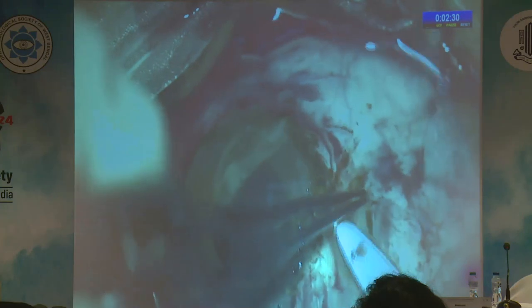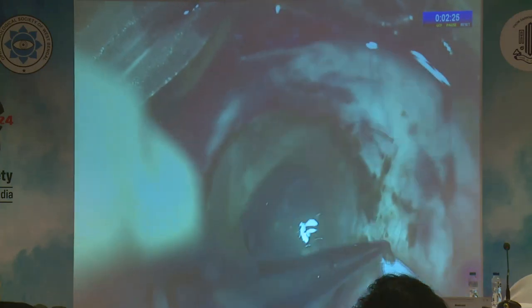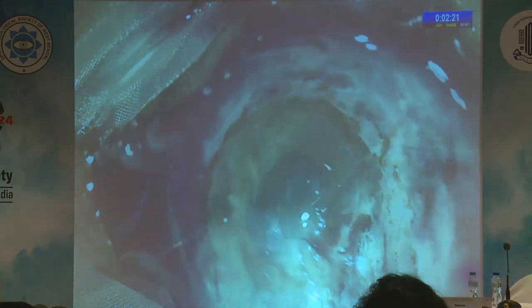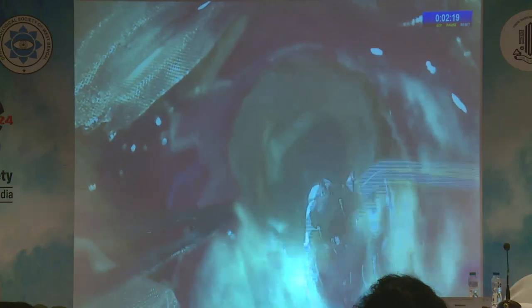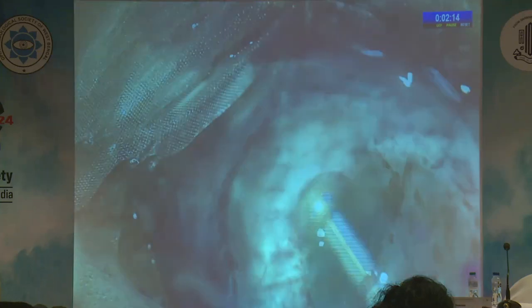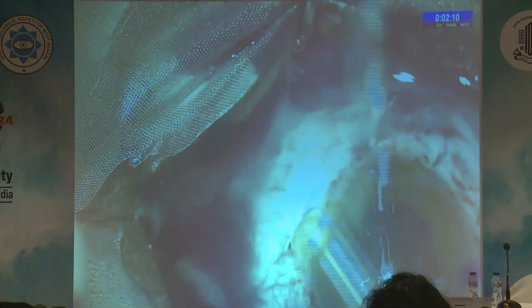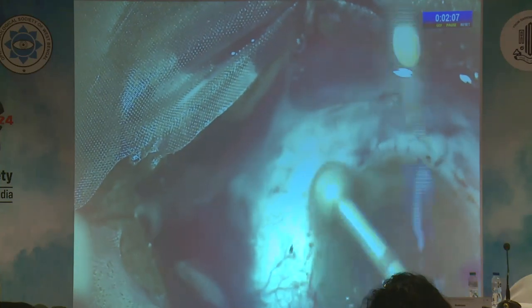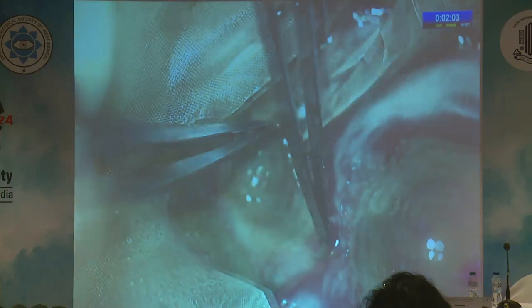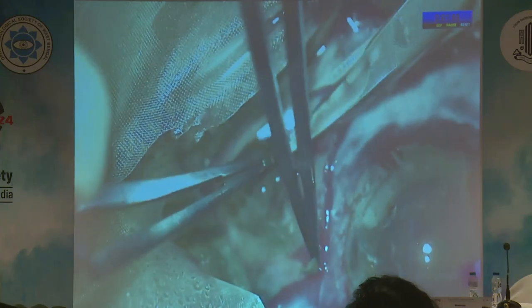In the temporal region, an area of deep episcleral invasion was noted, which was removed by superficial lamellar dissection. The rest of the nevus was cleared by multiple techniques, ranging from scraping with a blade to lamellar dissection. A diamond bar polisher was used to remove the residuals of nevus over the cornea. The part over the caruncle was removed partially to avoid damage to it, as dense adhesion to the underlying structure was noted.